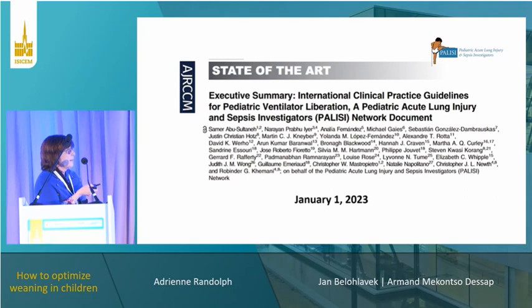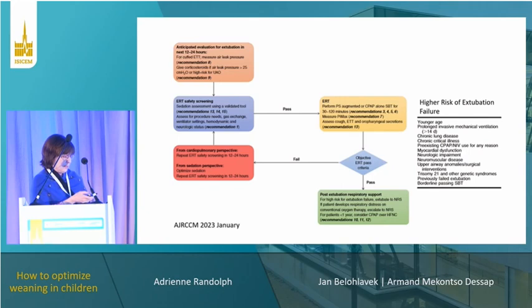And so this was the latest. It was a PALISI Network document, international, with a lot of different people weighing in, published in the Blue Journal. You can't really see this, but it's evaluating for extubation, doing a safety screen, and then looking at cardiopulmonary status. Then they have this group at higher risk of extubation failure, which looks very similar to what I showed you before, who might need to go on non-invasive support. So extubate them to a higher level of support, since they're at more chance of failure.